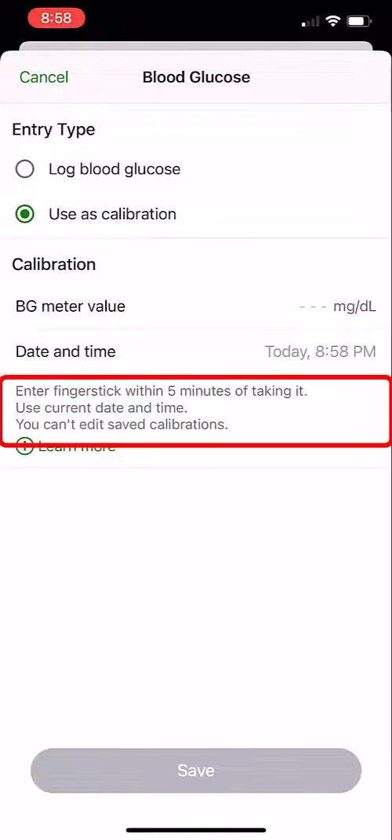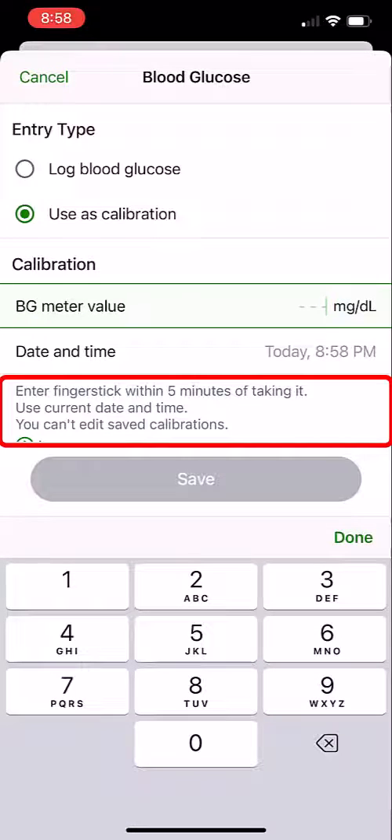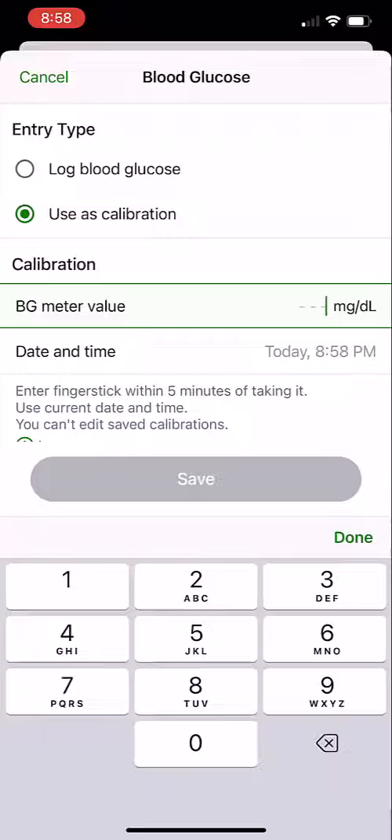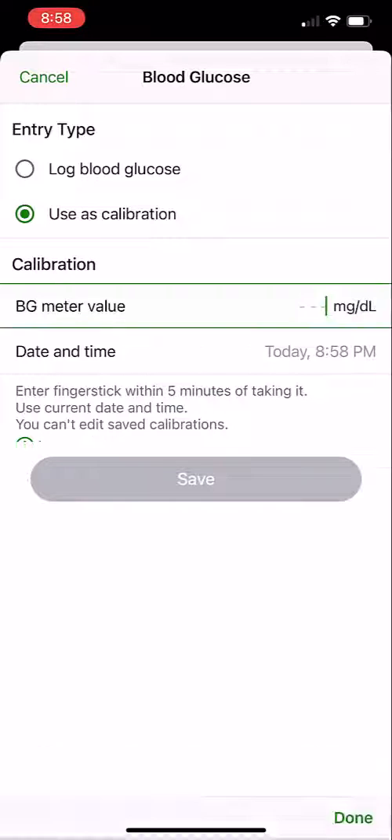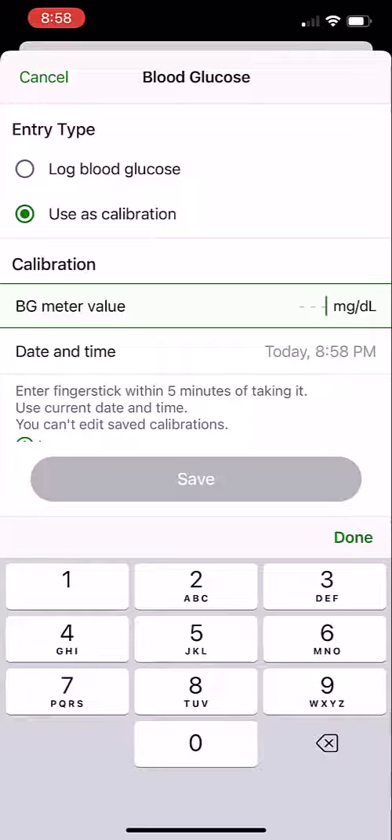It's a finger stick that has to be taken within five minutes. Put that in and make sure it's as close to the date and time — in this case 8:58 PM — and click Save.